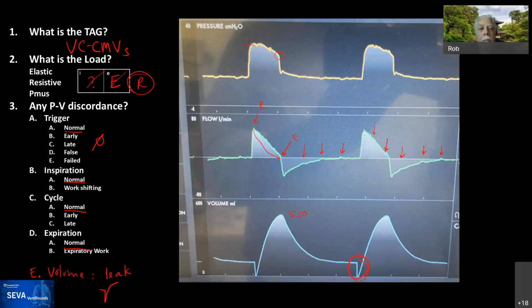So meaning you're able to, if you think about this, the way that I imagine this, and please Rob correct me if I'm wrong, is that because you apply the pressure, you can inflate the whole lung at the same time, and the extra flow that is needed goes out through the BPF or the hole that you have, so you can maintain the size of the balloon by putting more pressure, and you can inflate it as much as you need because the flow will escape.